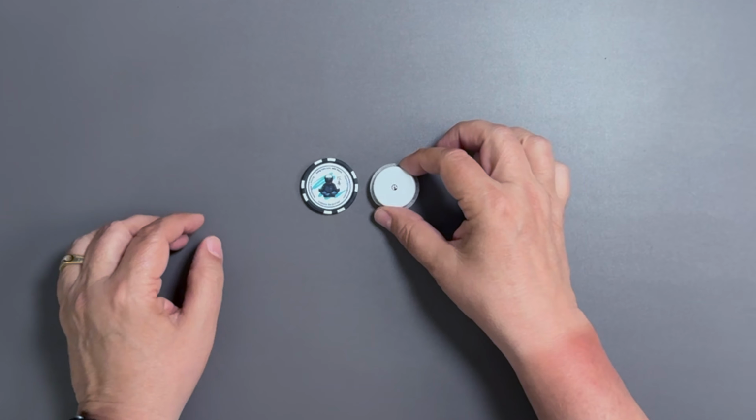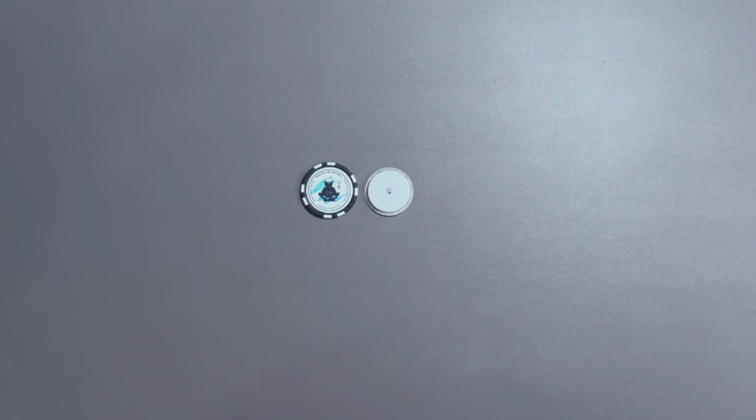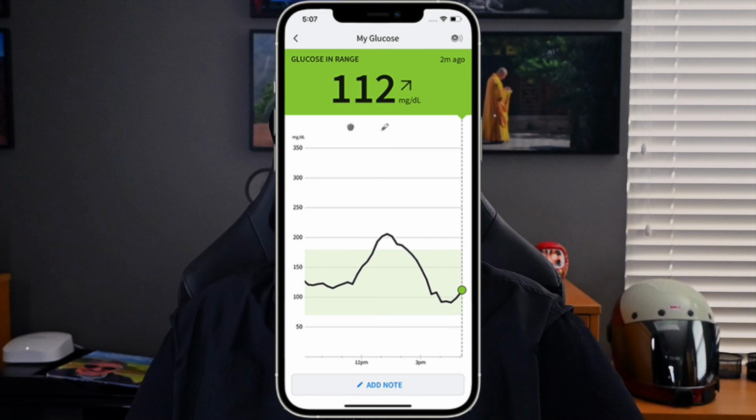This CGM takes a glucose reading once a minute and then records your level. It keeps a rolling data window of 8 hours stored in the device itself. Using an app on your smartphone, you simply press a button on the app, then touch your phone to the sensor to transfer that data to your phone. What you see is your current level, where it's at, and also a graph depicting your glucose levels over that rolling window. And that window is appended to your previous readings. So if you take a reading every 8 hours, then, well, you capture an entire 24-hour period of data.